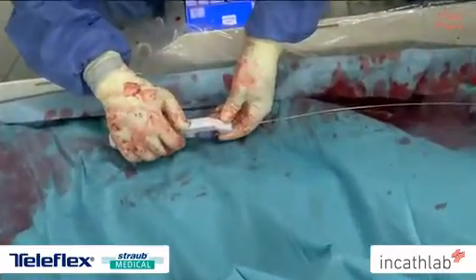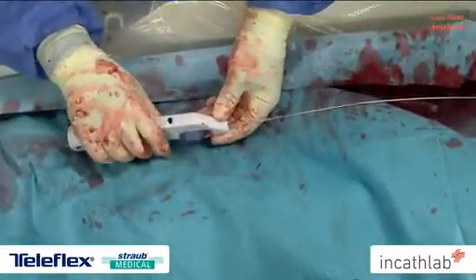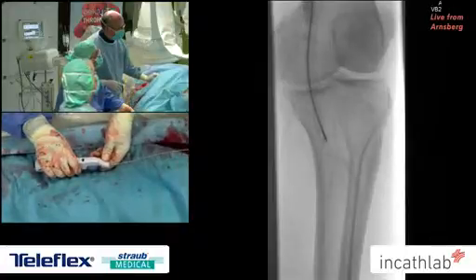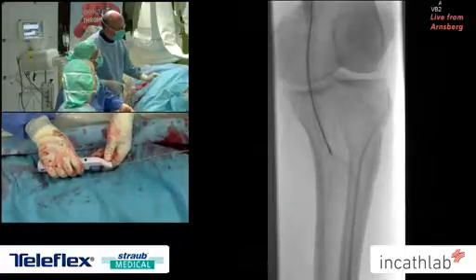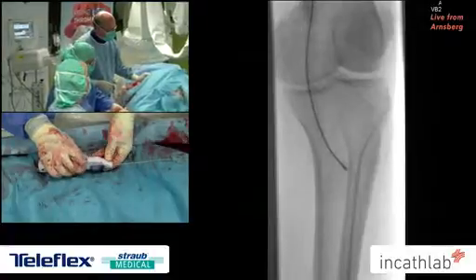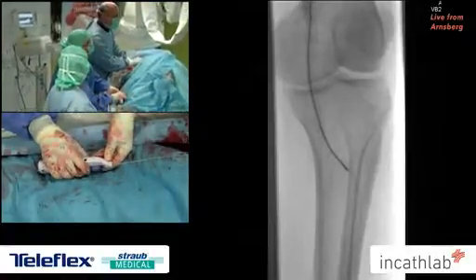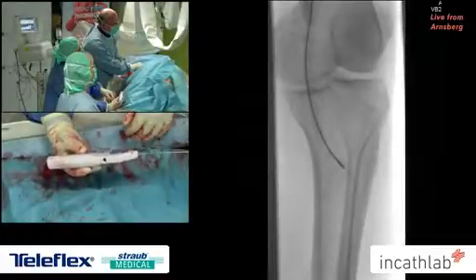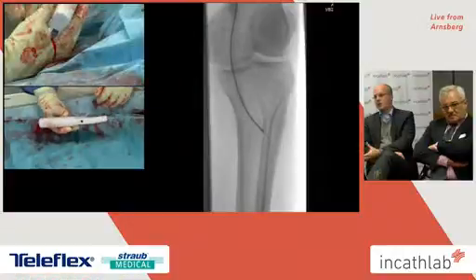We performed it. So it's a rotational device, or is it front cutting? Front cutting rotational device. Yeah. And the advantage is the setup is very fast. Half a minute setup. And it's sucking out material? It's working with the Archimedean principle, like the Rotarex. It's a little bit like Jetstream, similar to this, or a different kind? Different, because Jetstream has no Archimedean principle.